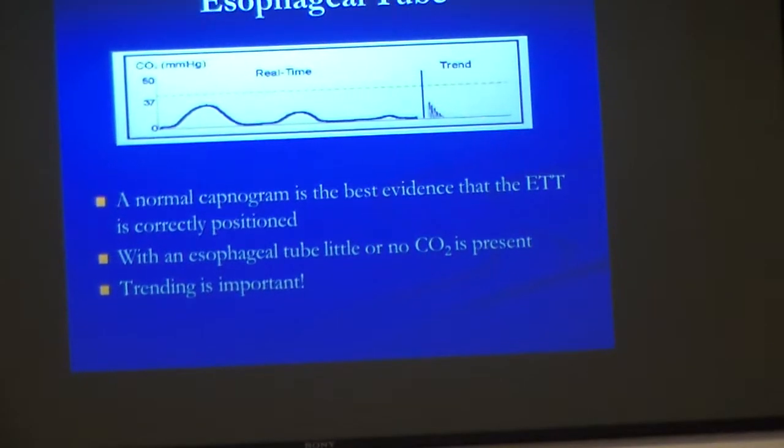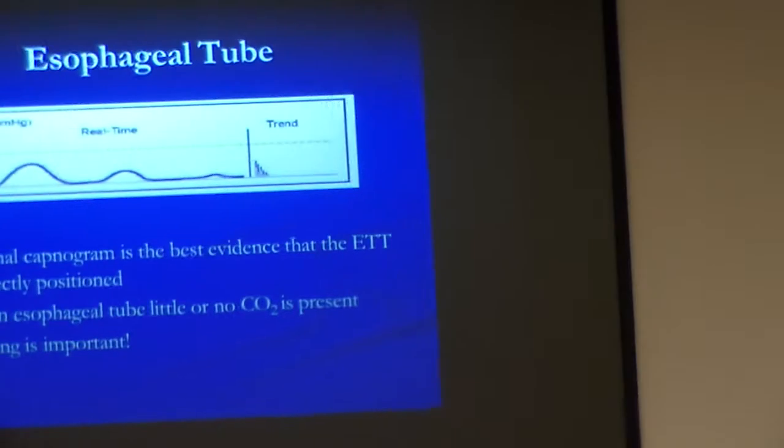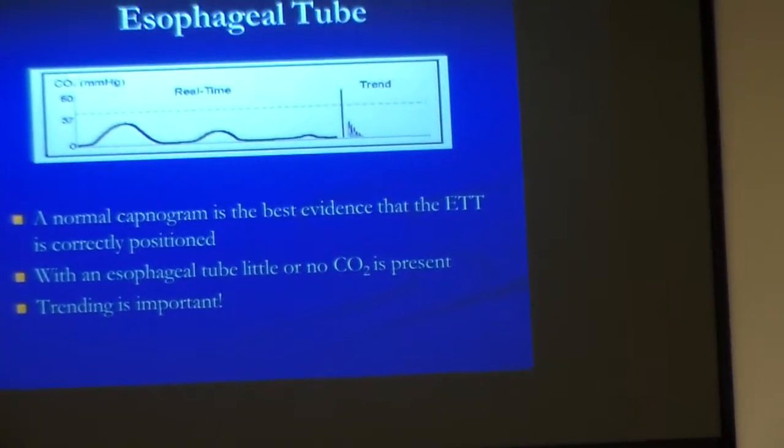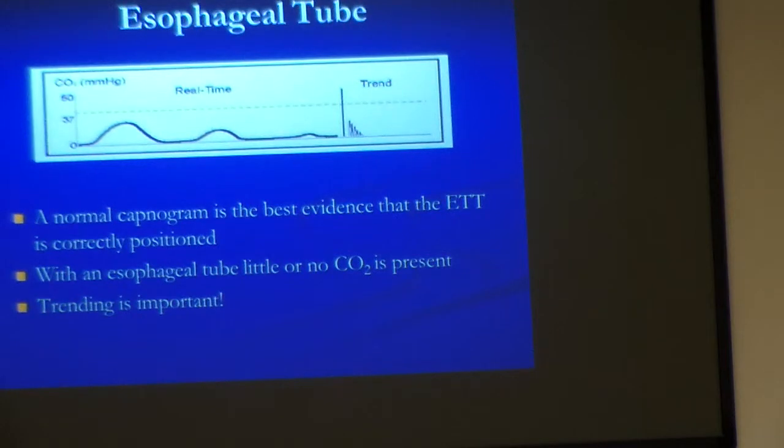Like with blood pressure, it'll give you an empirical value, but only if you're taking a blood pressure or pressing snapshot, and then it will store it. Right, but I'm just wondering, you know how you can go back in and get all your blood pressures, would it give you a trend? Yes, it will. It'll give you the numbers, you won't get a graphical waveform, but you'll have numbers, but only if you push snapshot on it.